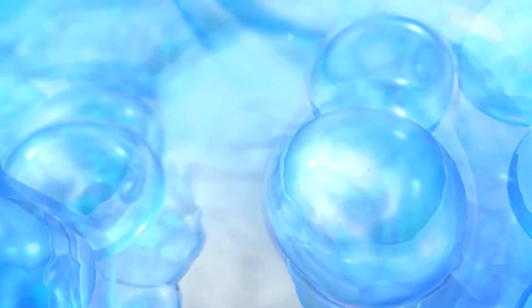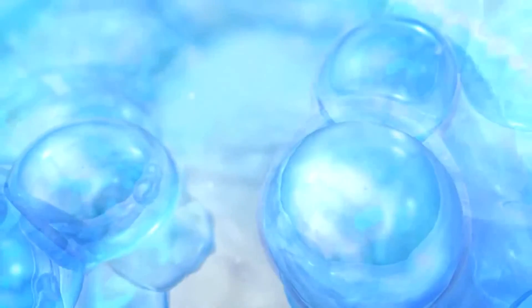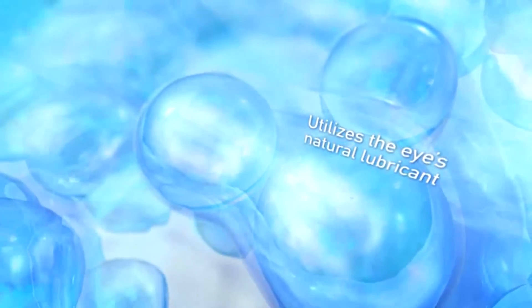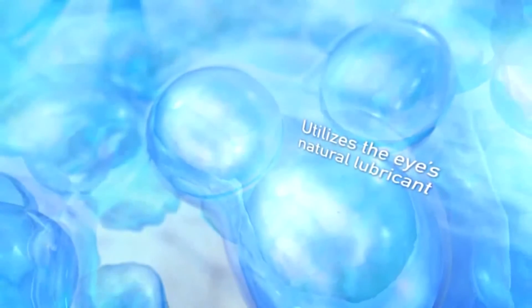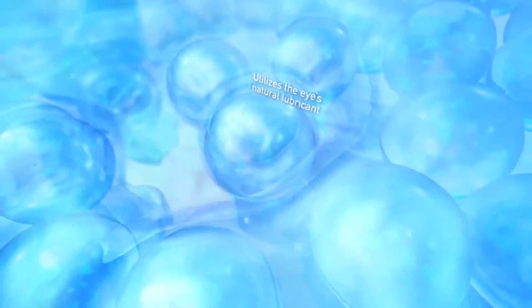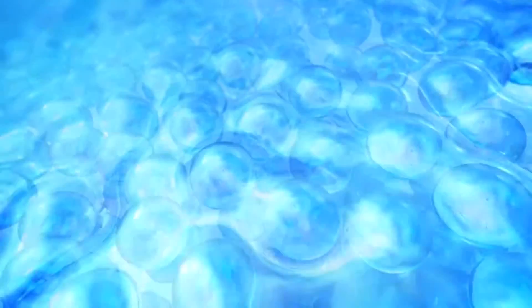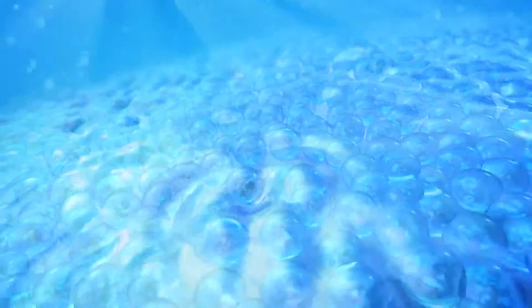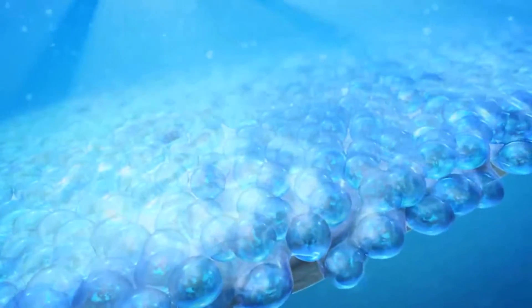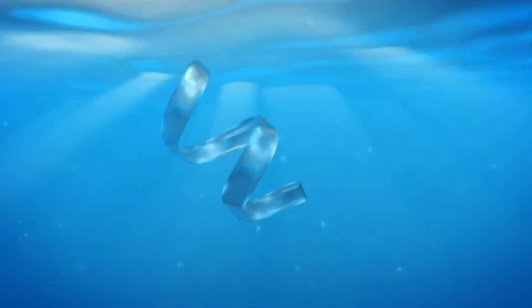To help hydrate lenses, BioTrue utilizes hyaluronan, the eye's natural lubricant. BioTrue forms a free-flowing network on the lens surface, drawing in water to envelop lenses in a hydrating cushion.